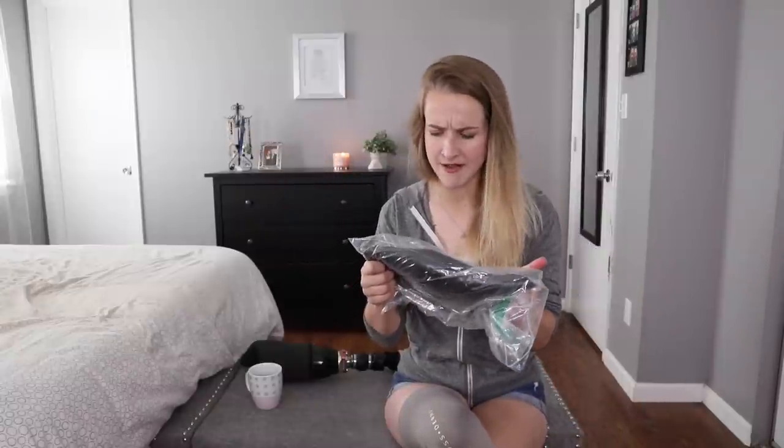That's my amazing prosthetist Zach Harvey and his team up in Denver — Creative Technologies Prosthetics. Check it out if you are an amputee; I cannot recommend them highly enough. I am not paid to say that, I just happen to love them. They sent me down an extra sleeve, and this is actually a new kind of sleeve I haven't tried before, so this will be interesting for all of us.